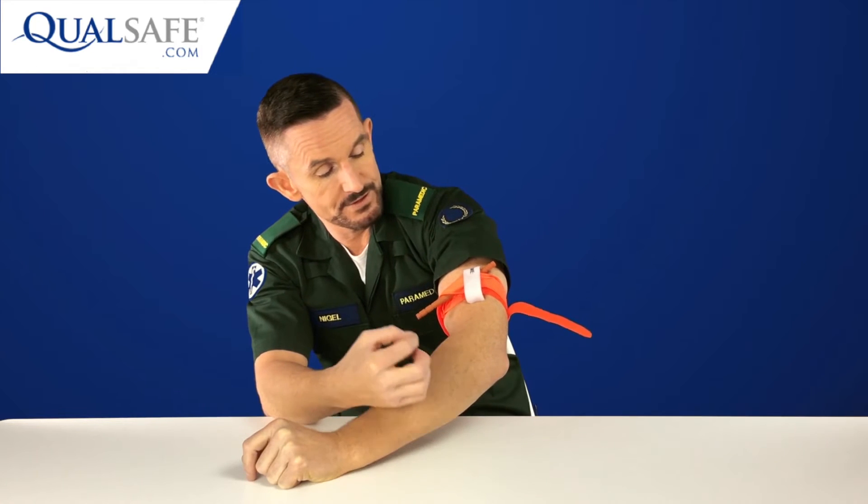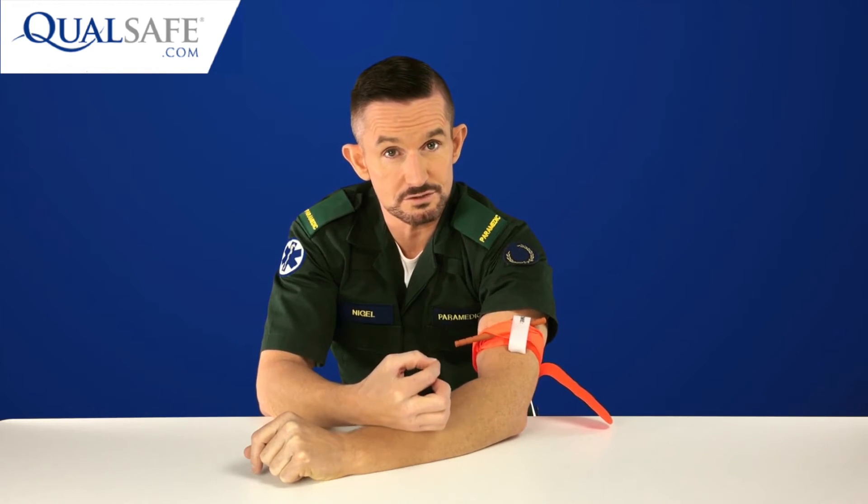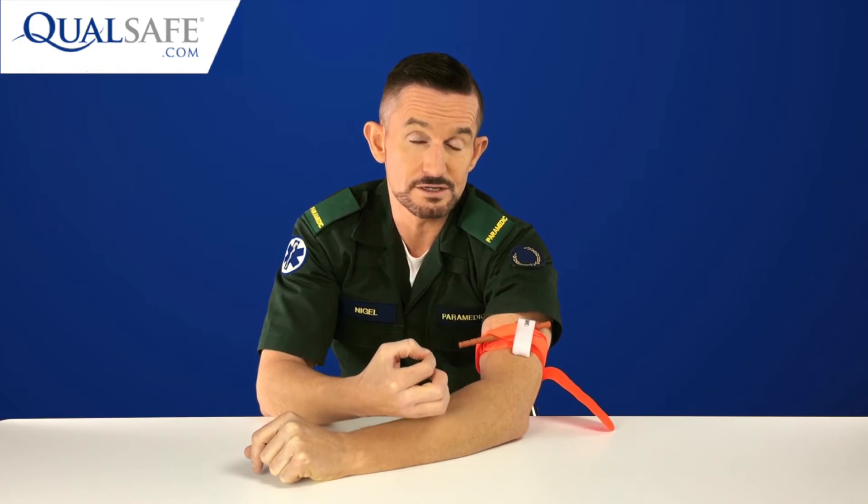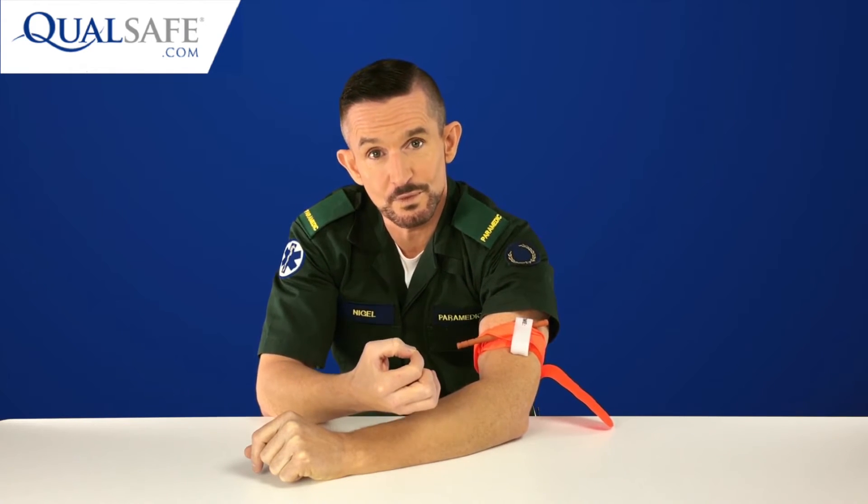This tourniquet should stay on the patient and should not be loosened or removed. Even if the patient protests about pain, all we can do is reassure them that the pain is necessary because it is saving their life. The pain does start to subside — it probably goes numb after a certain amount of time — but we can't remove it or loosen it off.